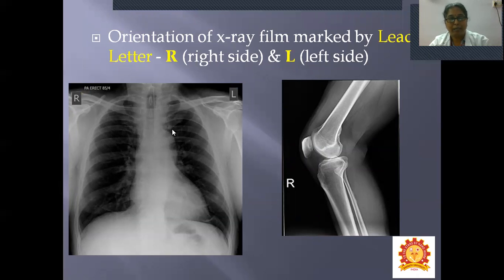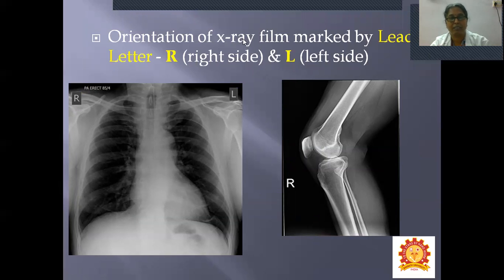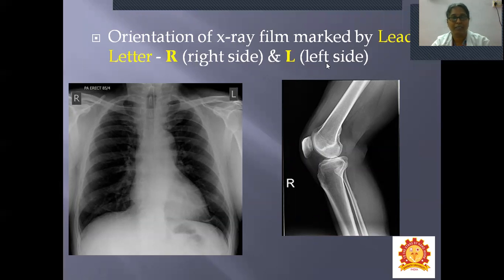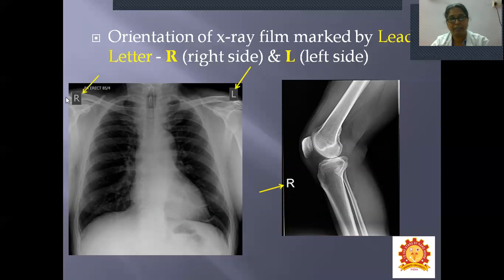How to locate the orientations of an X-ray film — which is the right side and which is the left side? This can be marked by a lead letter. At the top of the X-ray film, either on the right or left, you will see the letter R or L. Letter R stands for right side and letter L stands for left side. For example, R on a lateral view of an elbow joint indicates it is the right elbow joint.